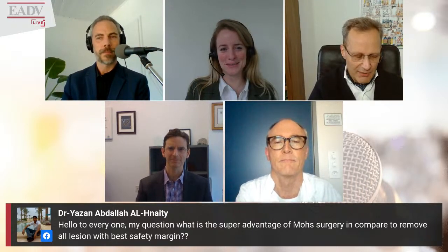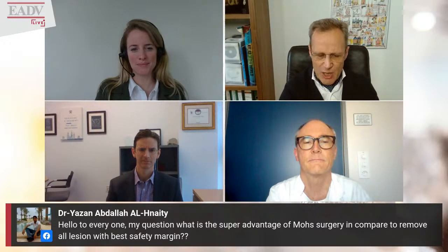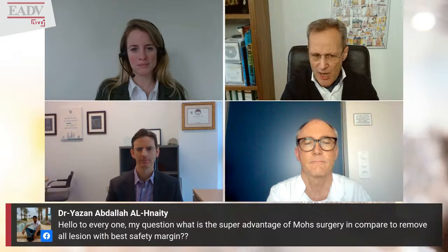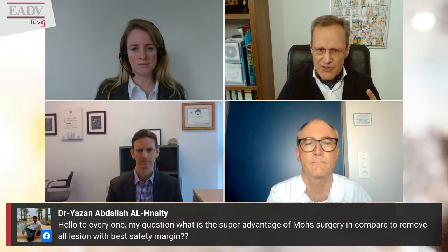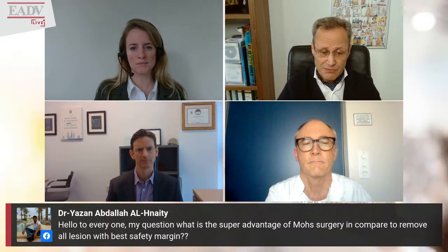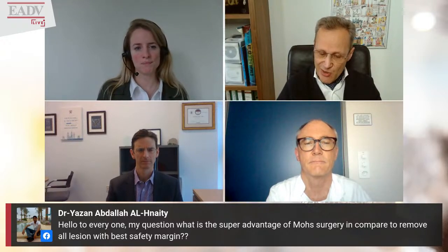Yes, first of all, as I have mentioned earlier, with conventional surgery, you never know if you completely excise the tumor, and especially you see it very well with tumors like dermatofibrosarcoma protuberans, where you couldn't see the margins of the tumor, and you could see it only under the microscope. And we excise with small margin, but we excise completely.